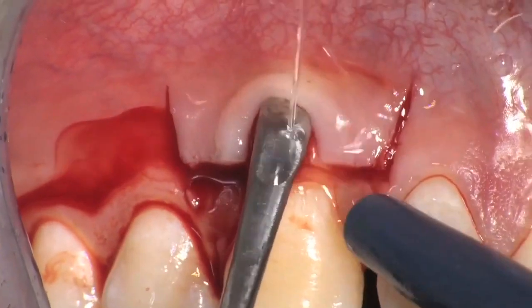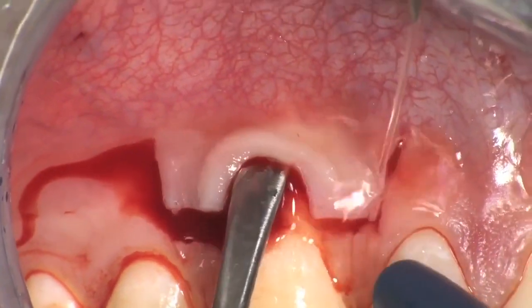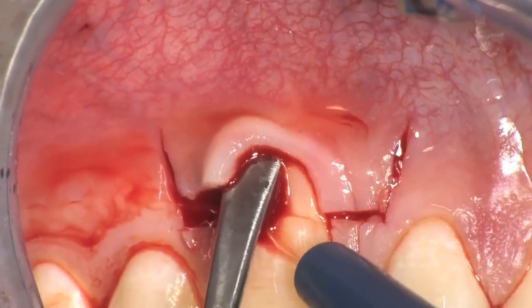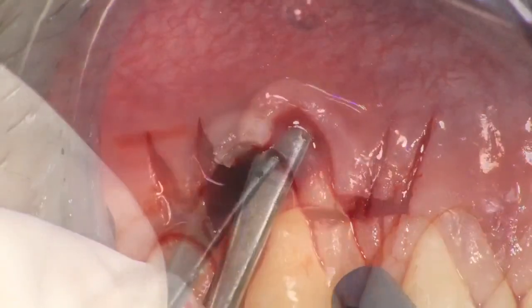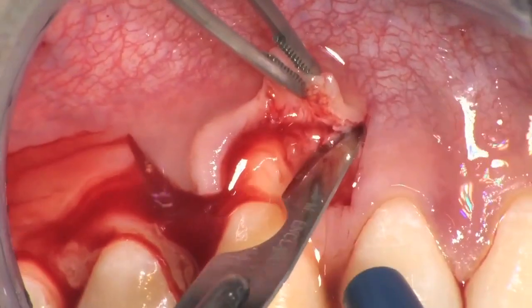The soft tissue apical to the root exposure is elevated to full thickness, inserting a small periosteal elevator into the probable area and proceeding in the apical direction in order to expose 2 to 3 mm of bone beyond the bone crest.